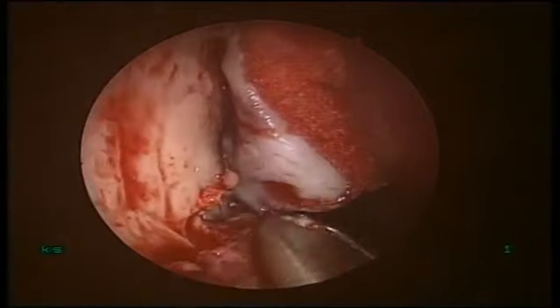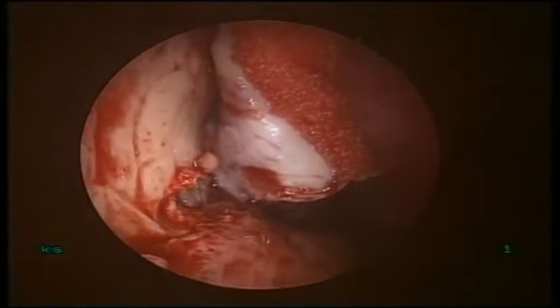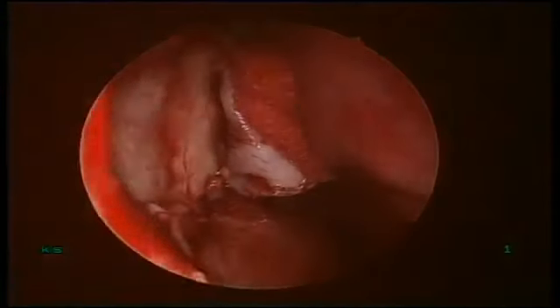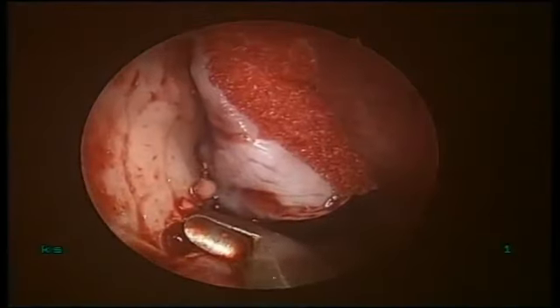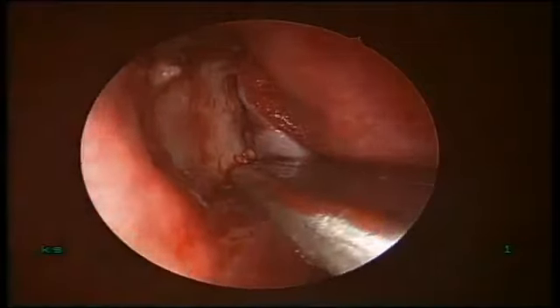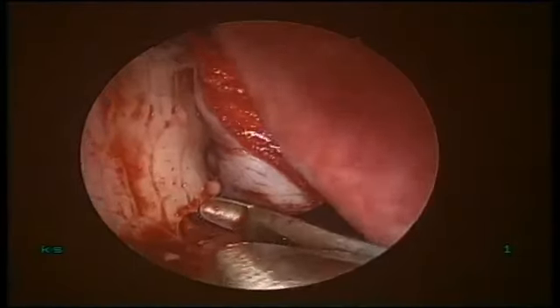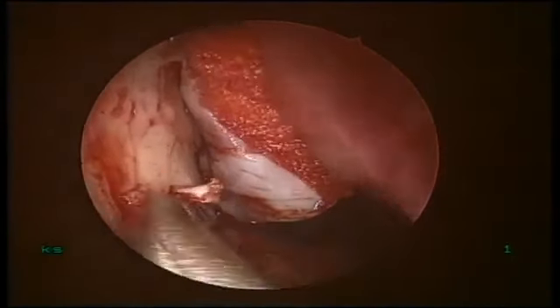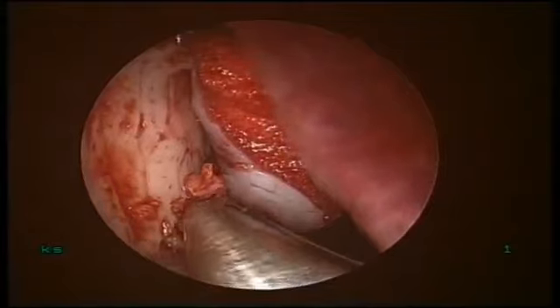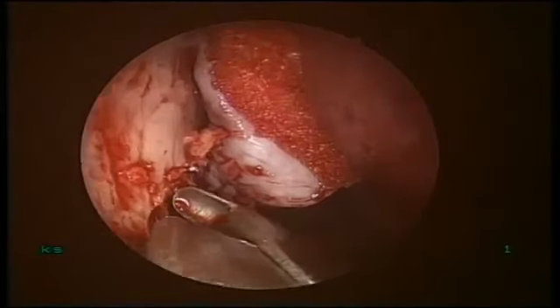Can you see? In the first go, you can be right on the system. If you find a nasolacrimal duct, see that duct? If I press, see that? If you find the duct and follow it up, it has to lead to the sac, nowhere else. So no point in looking for the sac here and there. Just find the duct below and follow it up. Yeah, just a 2 mm Kerrison punch. See this? And now keep following it up. And marsupialize not only the duct and sac but the entire nasolacrimal system. It will never re-stenose.